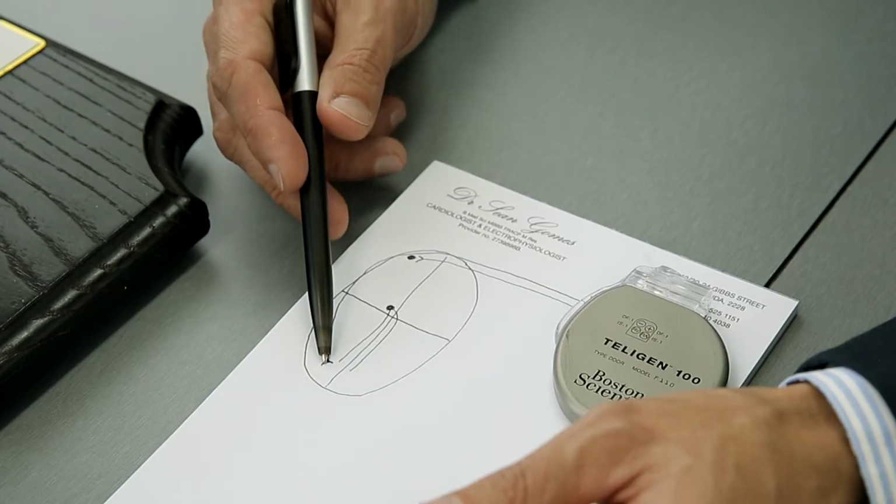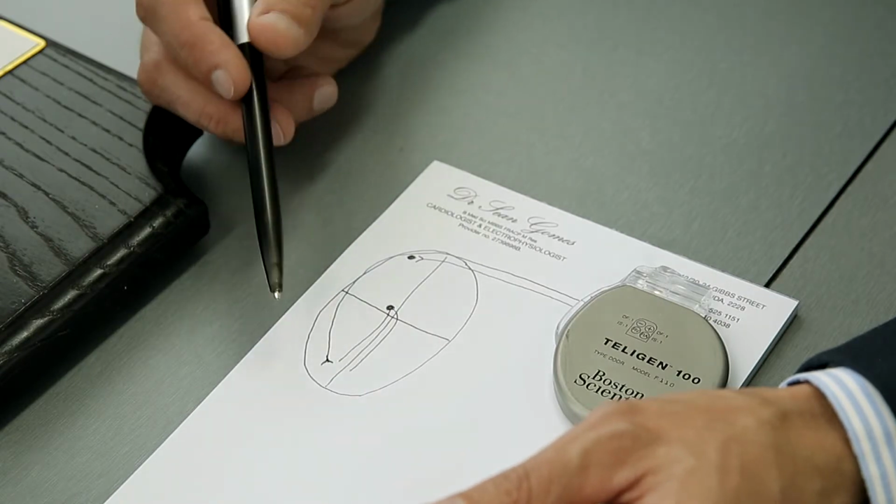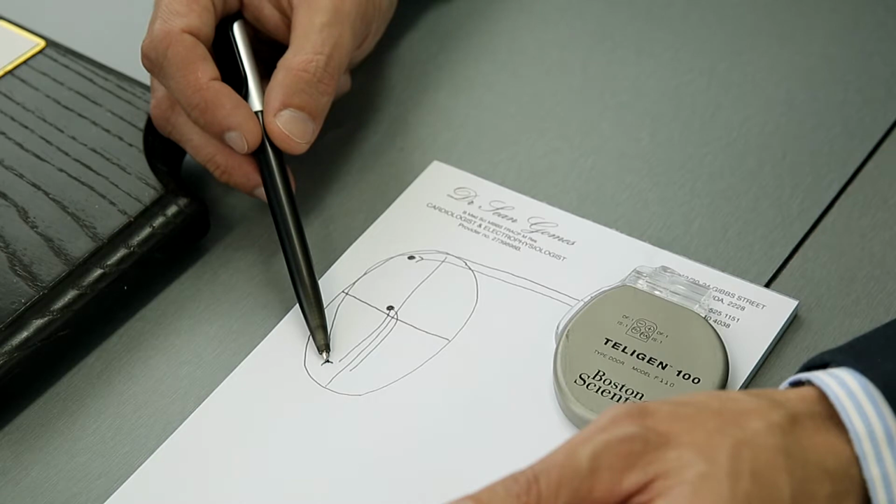deliver life-saving treatment. The other way a defibrillator can work is by delivering extra heartbeats into the heart in order to stop a short circuit in the heart. And those extra beats are delivered through the wire that attaches to the bottom of the heart.